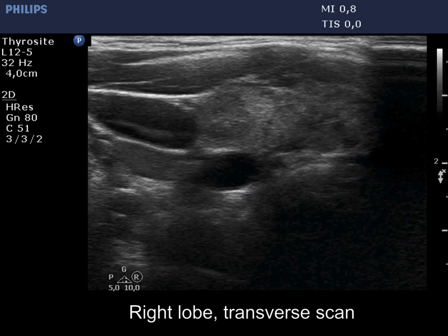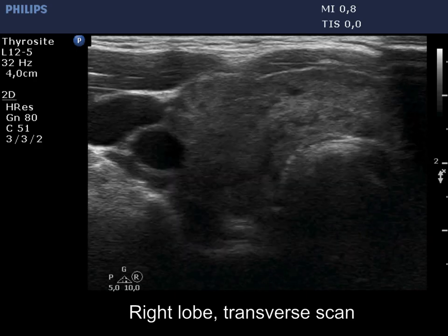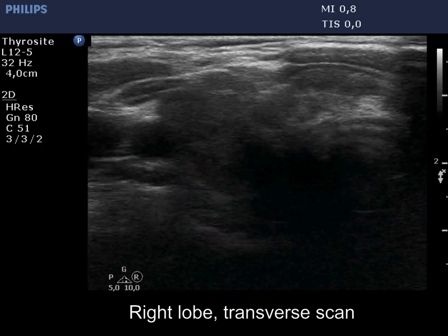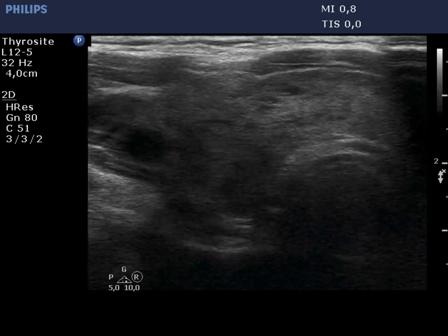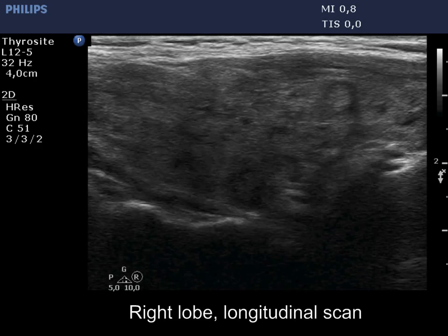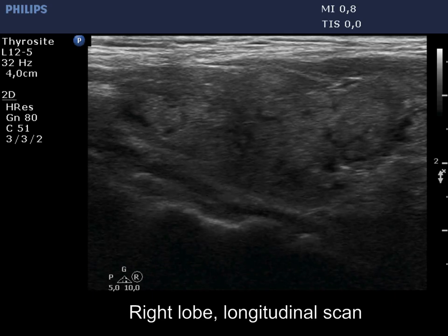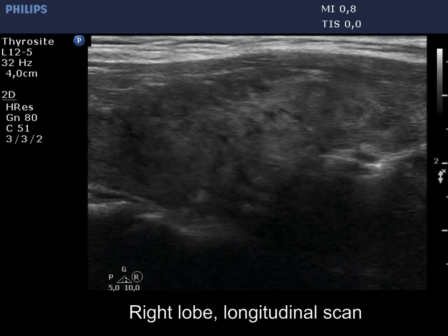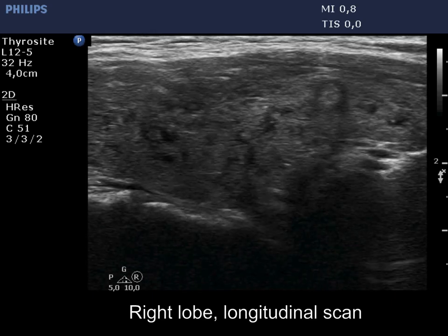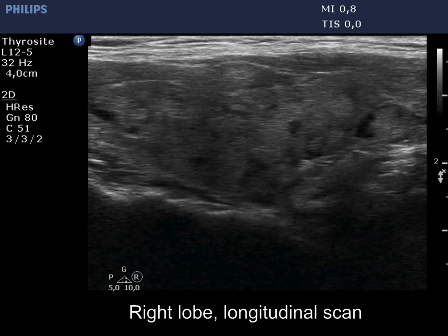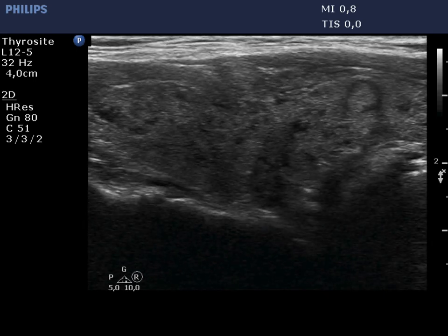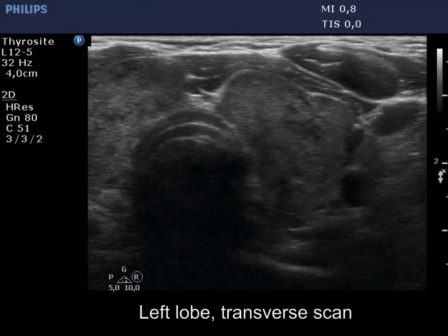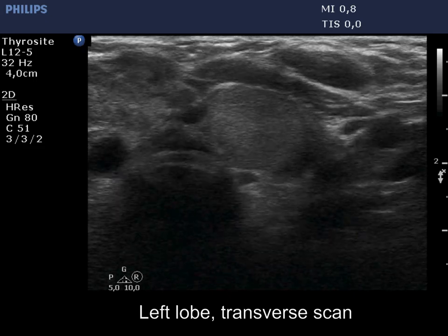The thyroid is composed of minimally and moderately hypoechoic areas. None of the discrete lesions corresponds to a pathological nodule. The left lobe has a similar presentation.